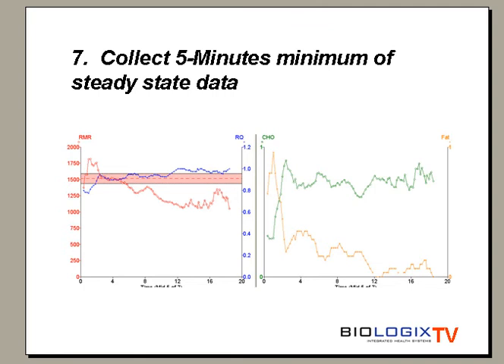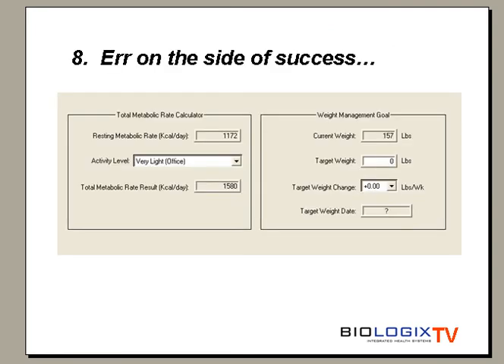Once you've excluded the unstable data in the exclusions tab and you're comfortable that you've amassed roughly 5 minutes or more of steady state information, you'll have the screen that shows the foundational RMR number. Congratulations! However, your work is not done. This number alone is not the magic or actionable data that your client needs.